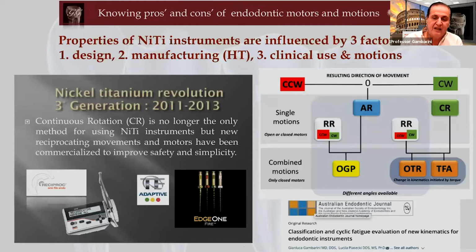So having said this, we understood quite a lot. We are not able, in a certain way, by the heat treatment, to increase the torsional resistance, but by having a lower operative torque, we actually increase the torsional safety of the X7 because they will need much lower torque values to be used. So they have a wider safety range of utilization.